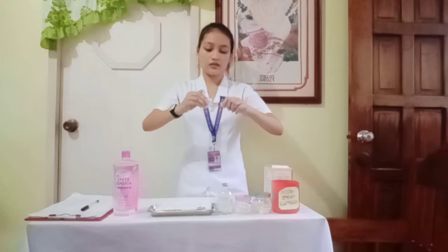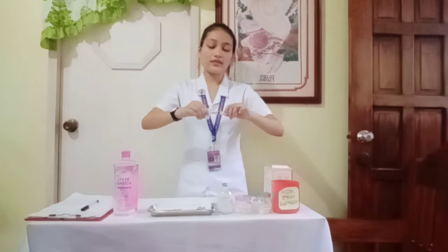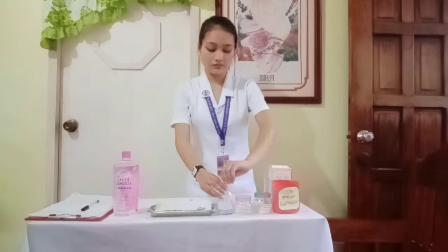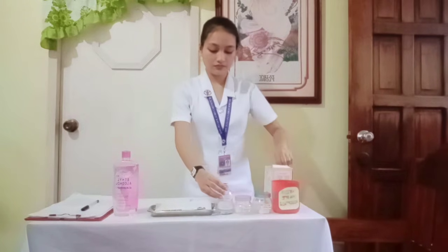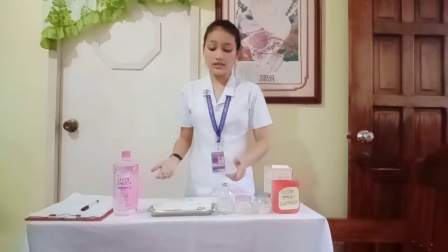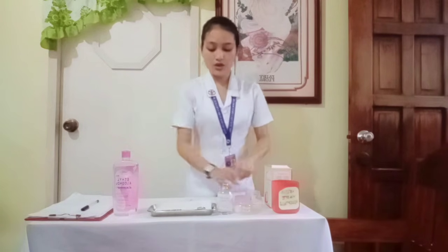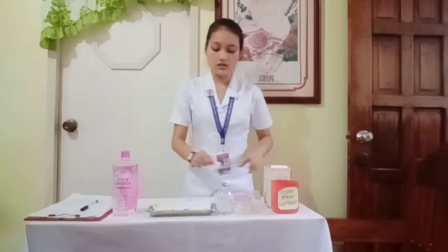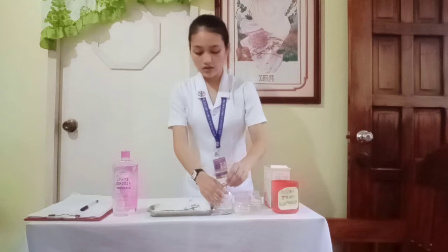Now connect the syringe into the aspirating needle. Be sure that the connection isn't loose to avoid injuries. Place it there, and then now we can open the medication vial. Now that the rubber seal is exposed, we should clean its surface with a cotton that has been soaked in a 70% alcohol. Do this for at least 30 seconds.